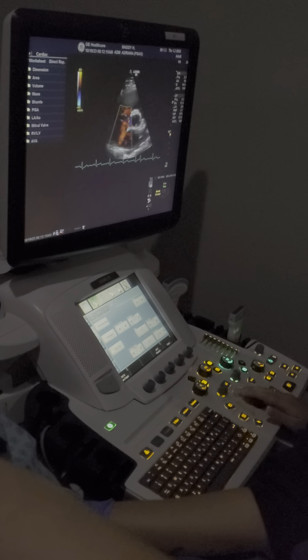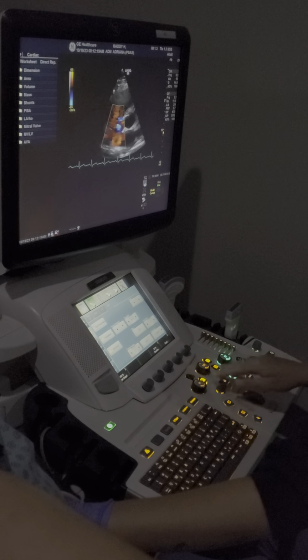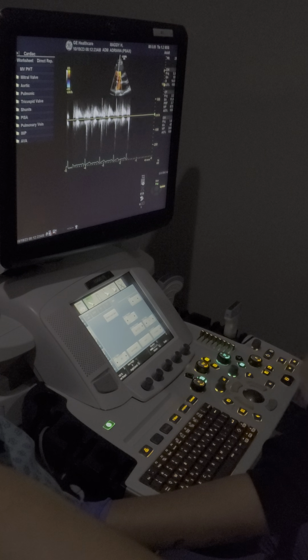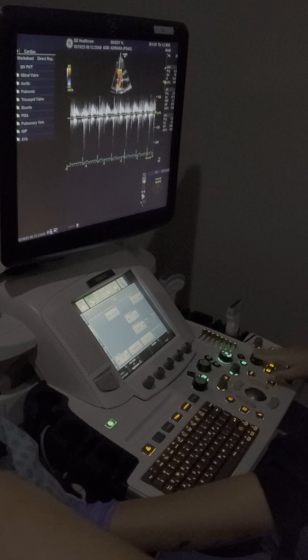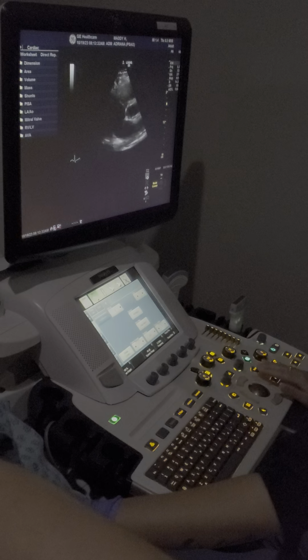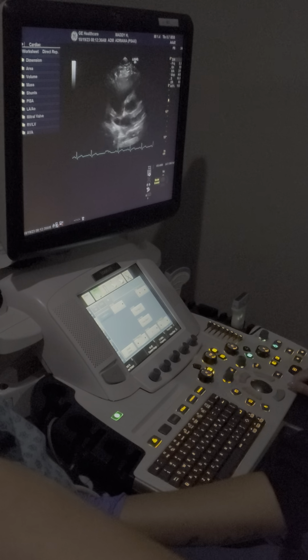Yep. So you did a black and white image of your tricuspid, then you'll do a color image, then you'll do a Doppler, just like how we did when we tilted into tricuspid and long, okay? Then your Doppler is an image, okay? Got some mild here. Okay, so that's it for that. My perfection only goes so far.